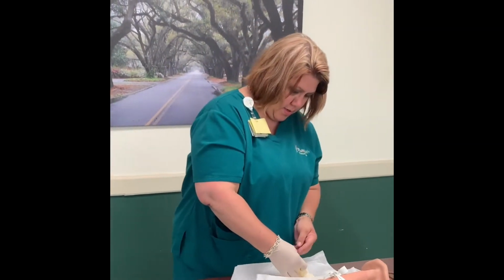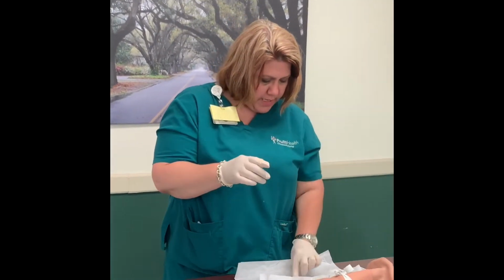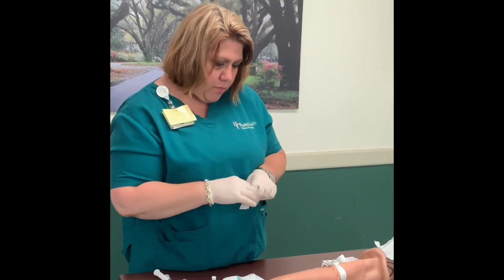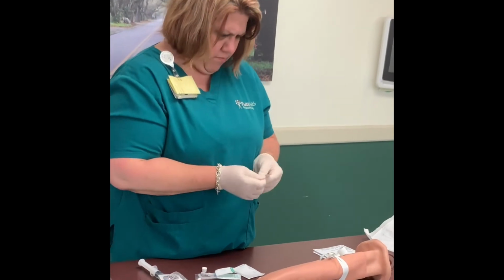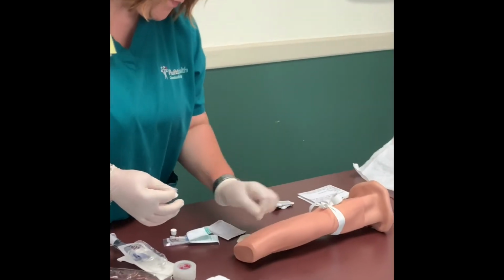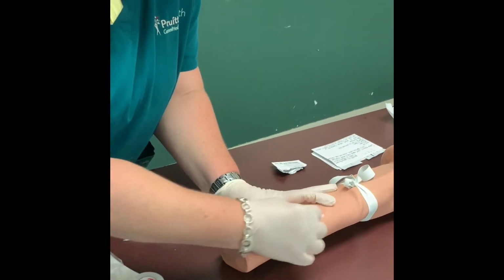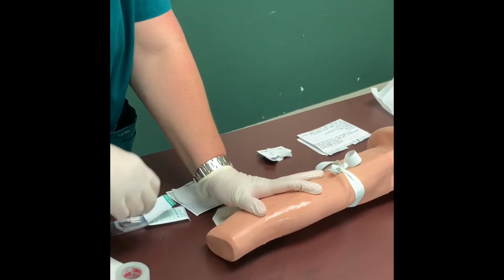And this one, you pick it up in the middle of the paper and you throw that in your trash can. Get your alcohol wipe, and whatever site that you're going to use, you're going to scrub around that area. So I'm going to use this vein here, and the way that I like to hold it is you want to kind of anchor the vein down that you want to use. Scrub around that site. Give it a few seconds, let it dry.